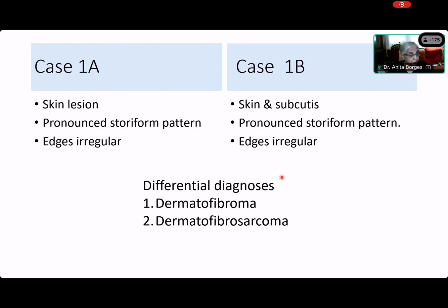All right. What about Priyamada? What is your diagnosis? Ma'am, dermatofibroma, but I also thought of deep fibrous histiocytoma. Deep fibrous histiocytoma, for what? On 1B or 1A? 1A. Ma'am, and for 1B I thought of perineurioma. Perineurioma. Oh, okay. Aditi? Oh, she's not there. Maybe. Diksha? I asked you. Dermatofibroma. Which one?